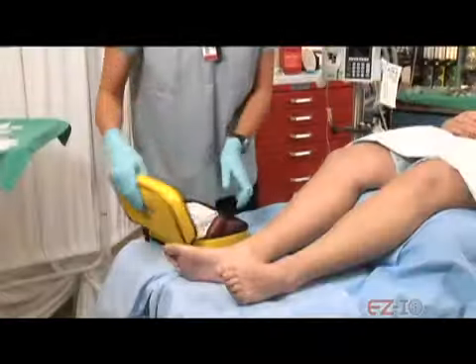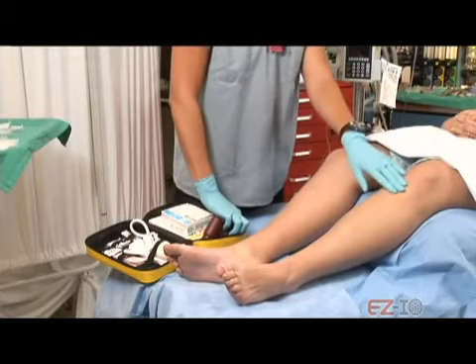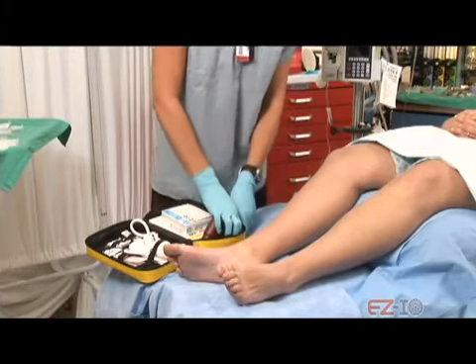Can't get a line. Somebody give me the EZ IO. Okay, I need to put a line into your leg. I'm going to put it actually into the bone. We can't get a line on you, an IV line, okay?